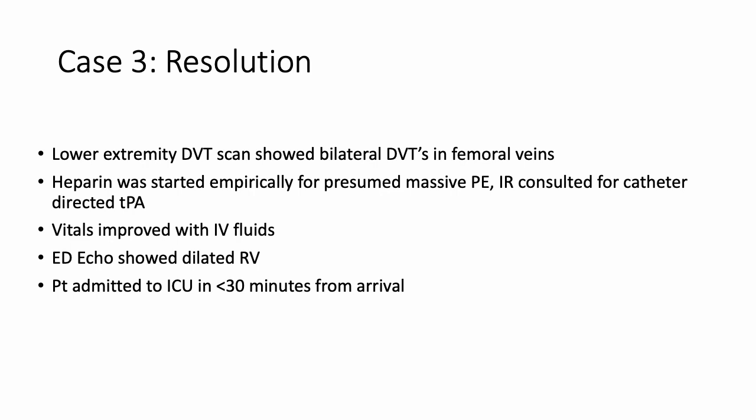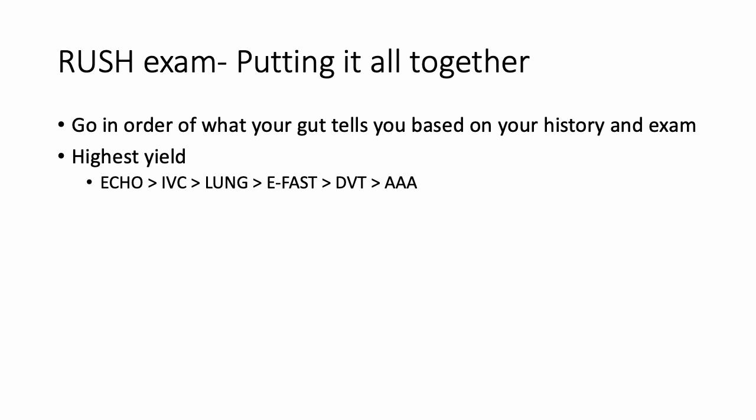He was admitted to the ICU very quickly, actually, which is another nice thing when you have diagnostics like this. You don't have to wait hours on end to get a consultative ultrasound or VQ scans, whatever else you're looking for. And so this can help your flow. So that's it. Putting the rush exam all together is the most important thing after you get all the different pieces.